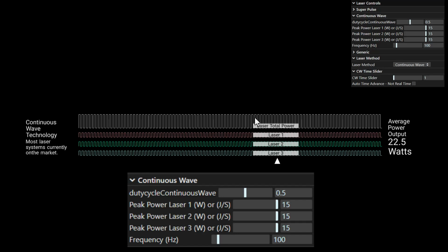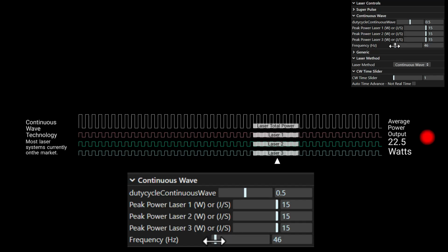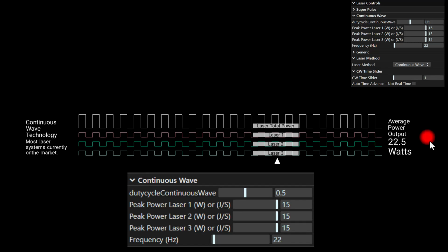So lights will seem like they're on constantly, even though they are turning on and off real quick, or at least it appears that way. You just can't tell that it's flickering. But that's alternating current. It's a little different story, but it's got a hertz value as well, on off. And so we're going to drop this back down again. I just wanted you to see that on off time. It's kind of neat to see because it shows you that these are just on and off. And that's all they are. That's all lasers do, is they turn on and off.